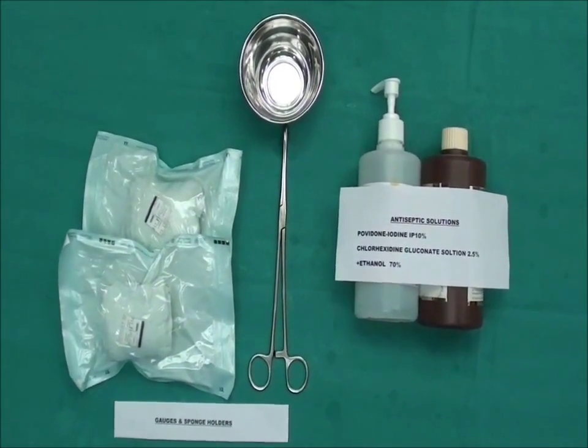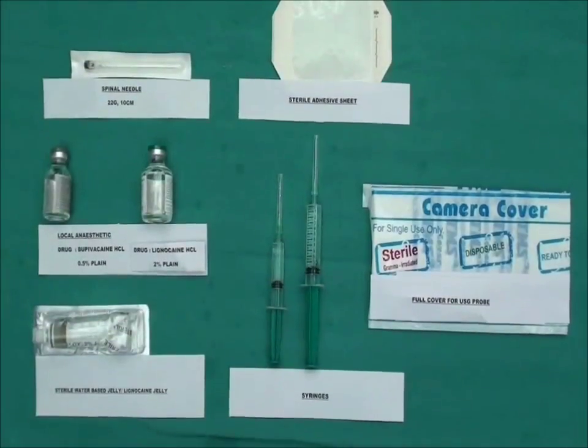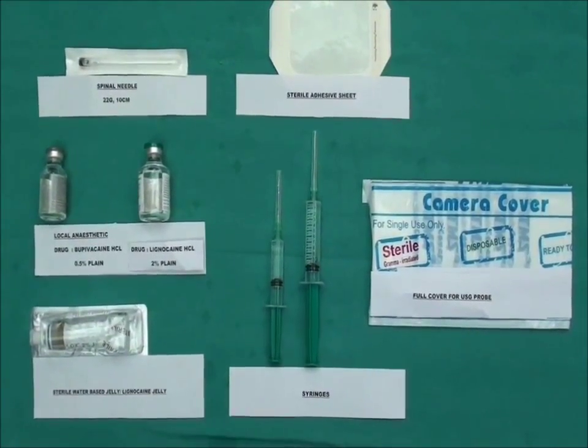We will need antiseptic solutions, sterile materials, along with local anesthetic, a 22-gauge 10 cm needle, a few syringes, camera covers, and adhesive dressings.